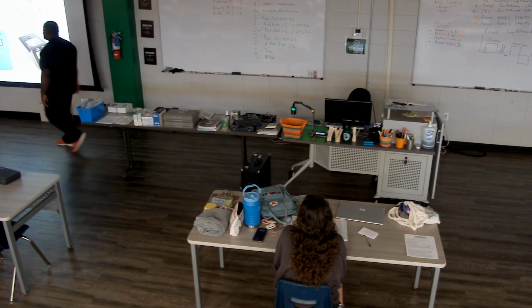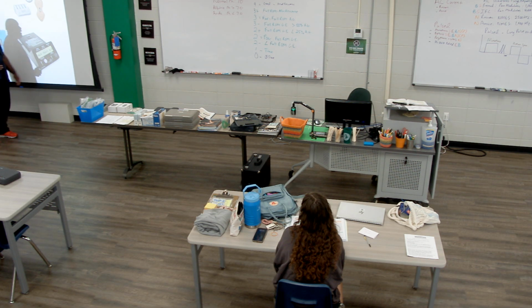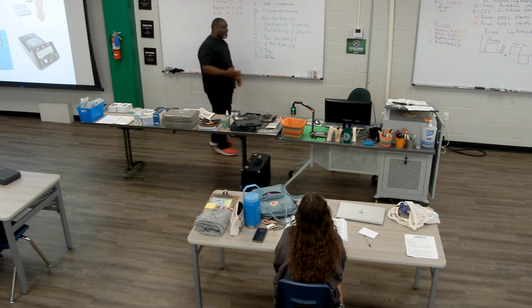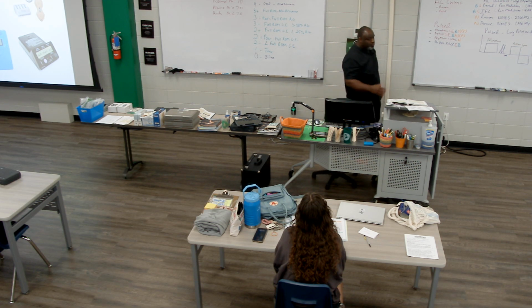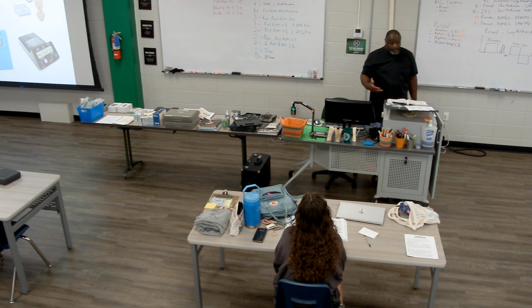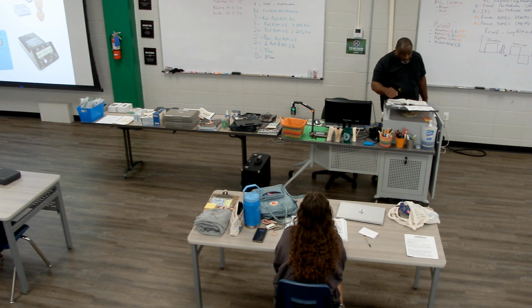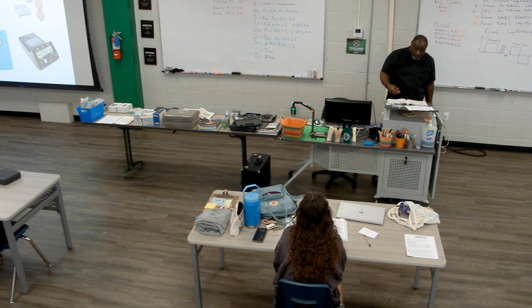You can do it for your hands and your feet. That same basin can be used for the foot. It helps to immerse the foot inside of there, and it stops sweaty feet. A lot of people say, my socks are always wet, it's pretty gross, I really need some help. So for sweaty hands and sweaty feet, iontophoresis is something that we could use. It can be used for hydrosis issues, sweating issues. When you see hydrosis, just think sweating.